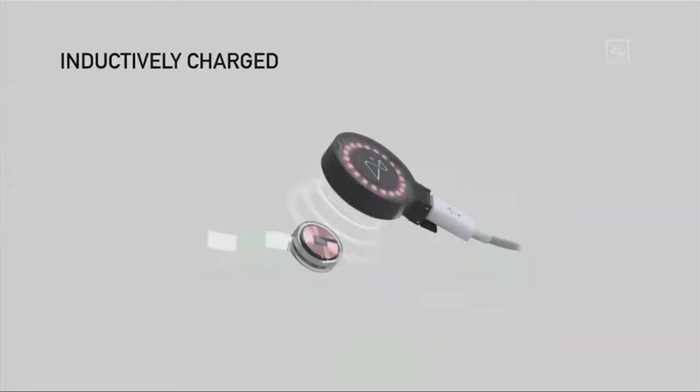It's also inductively charged, in the same way that you charge a smartwatch or a phone. So you can use it all day, charge it at night, and have full functionality. It would be completely seamless.